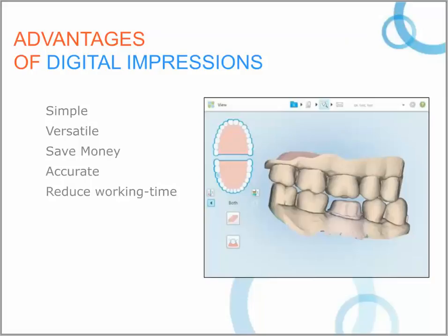So let's look at digital impressions a little bit closer. What is it about digital impressions that are advantages that make it useful for us in our dental practice? For one thing, it's simple. We don't have a large armamentarium of things: no tray, no syringe, no material, no two parts of material to mix together. All of those make that a much simpler procedure. We simply turn on the scanner and go in the mouth and take those scans.